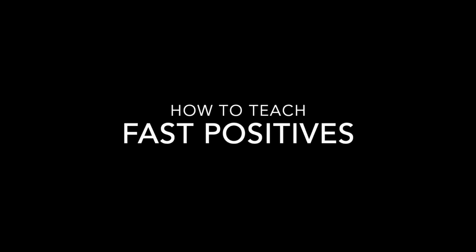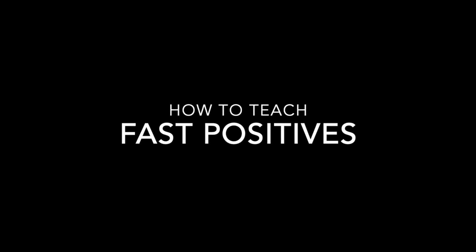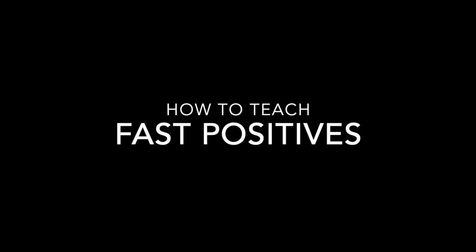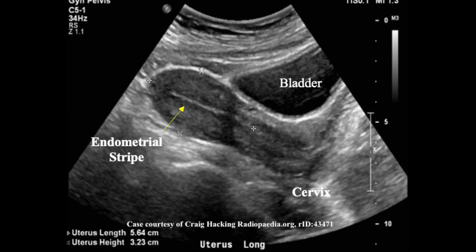Because the students are learning on normal models, it's important to go over with them where the fluid should be if the FAST exam were to be positive. So here we see a normal long axis female pelvis, and we can see the endometrial stripe, the pear-shaped uterus, and the cervix at the bottom, as well as the bladder.